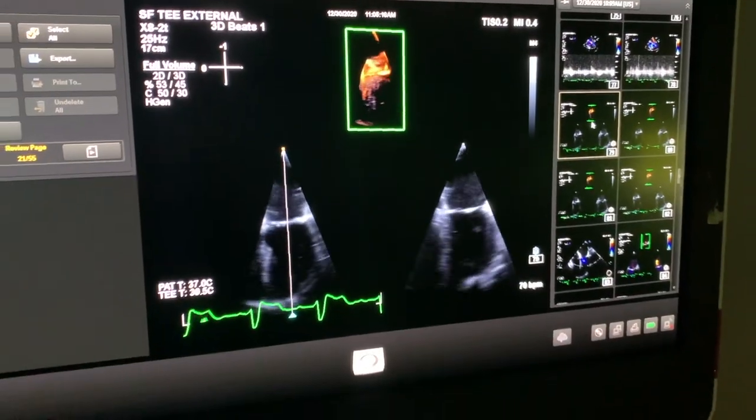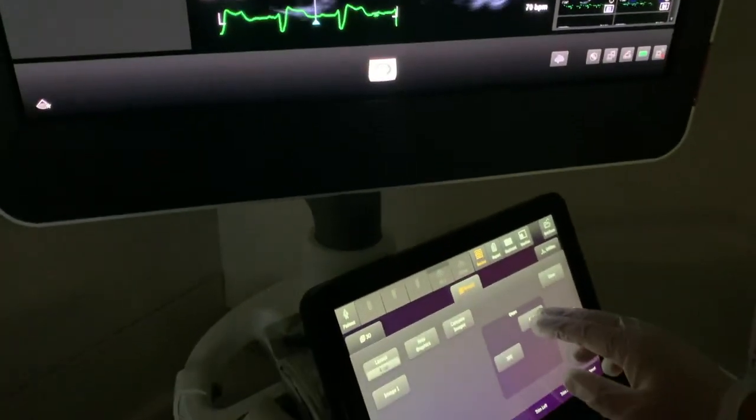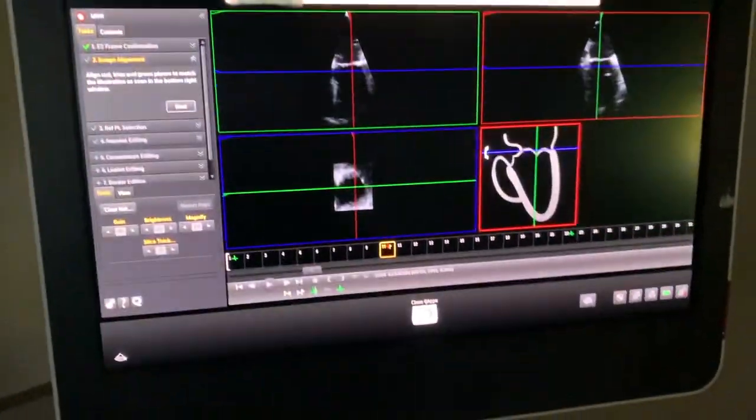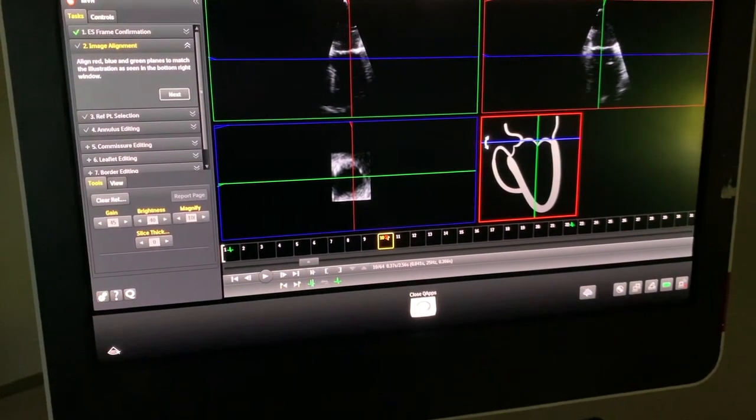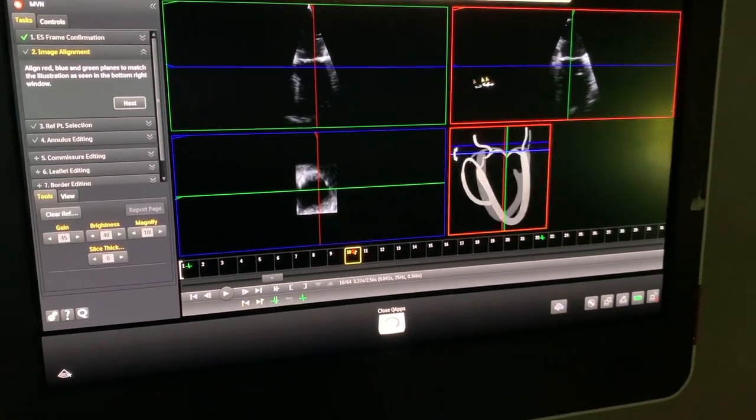Let's go now to the Echo Cart, where we have a 3D volume and launch MVQ, where we have this layout of four screens.